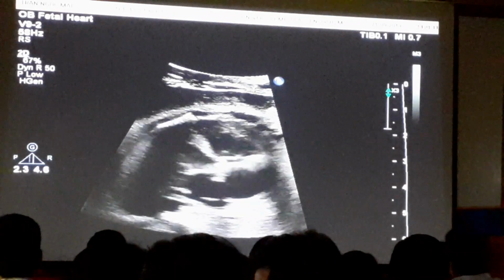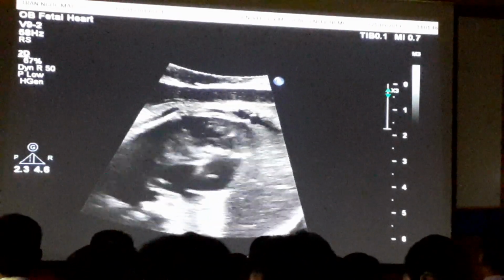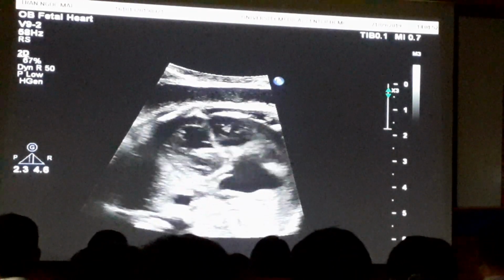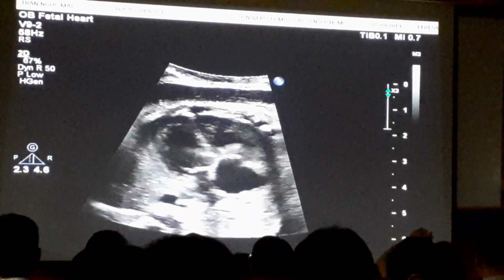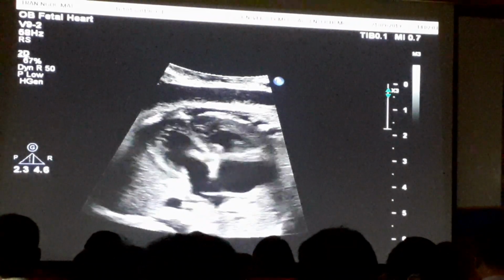So overall good prognosis, và như vậy là cái tiên lượng của bé này nó nhìn chung là tốt. An illustration of twin-twin cardiomyopathy in its resolving stage. It does take a couple of months sometimes for this to completely resolve. Và cái bệnh lý của cái truyền máu song thai này nó có mất một vài tháng, và mất một vài tháng lúc đó nó đẻ rồi.